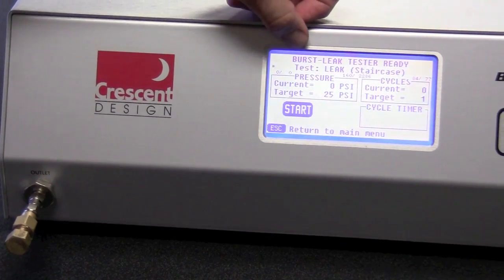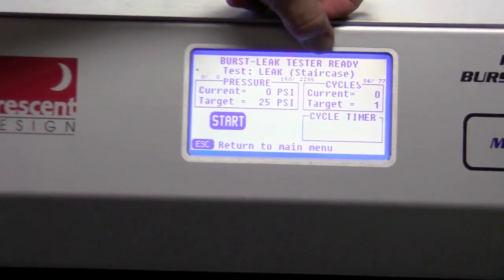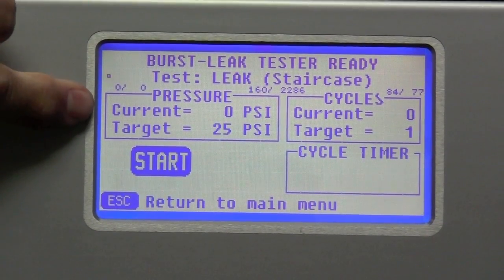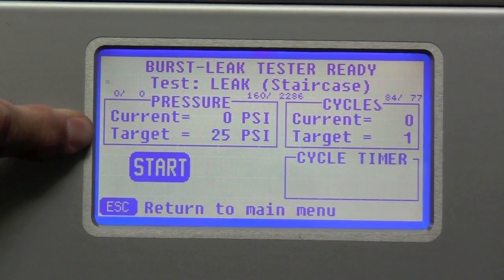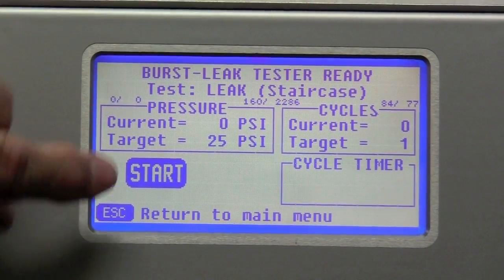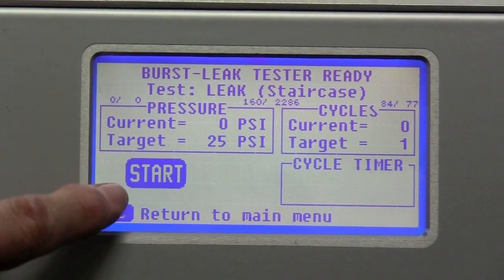So here is the main screen for the test. It says that it's ready. The test is a leak, and it's a staircase test. You see the pressure currently is 0 and the target is 25. The cycles, 1 is the target. And we're going to hit start.